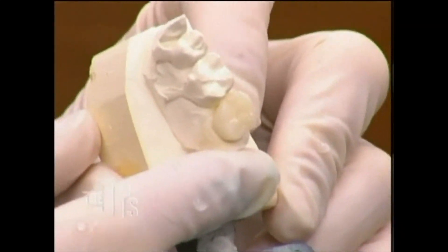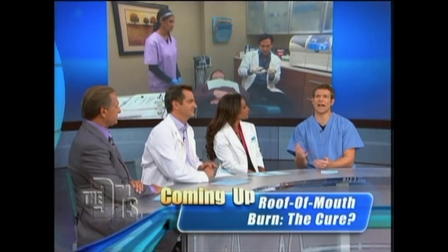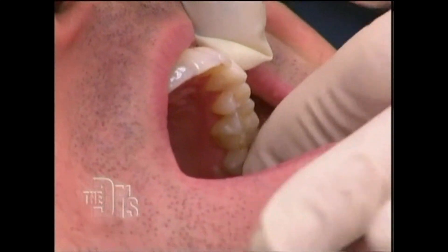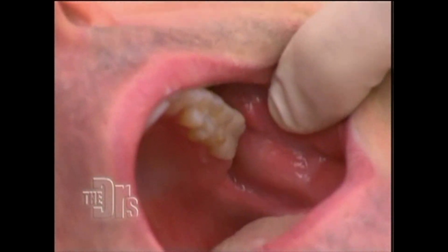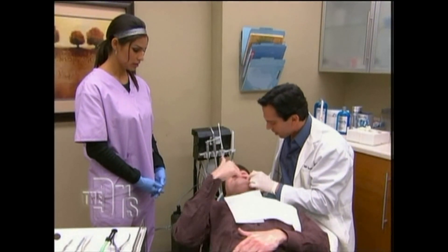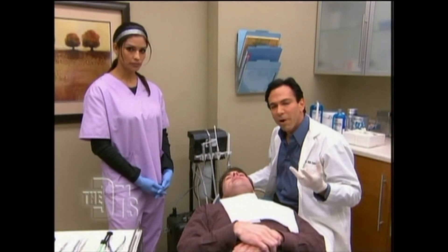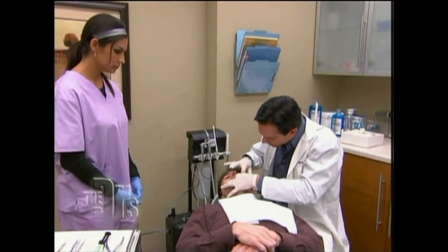That's fantastic — that's cool. So Kevin's now ready for his crown, and then we're going to reverse his anesthesia, right? That's right. So let's try it in and make sure it fits well. There we go — you can see it's a perfect color match. Yeah, that's amazing. All right, Kevin, go ahead and close for me. How's the bite? Not only does the color match, the bite's perfect, the margins are perfect — he can even floss in between his teeth. So we'll just go ahead and cement this on for you now, Kevin.